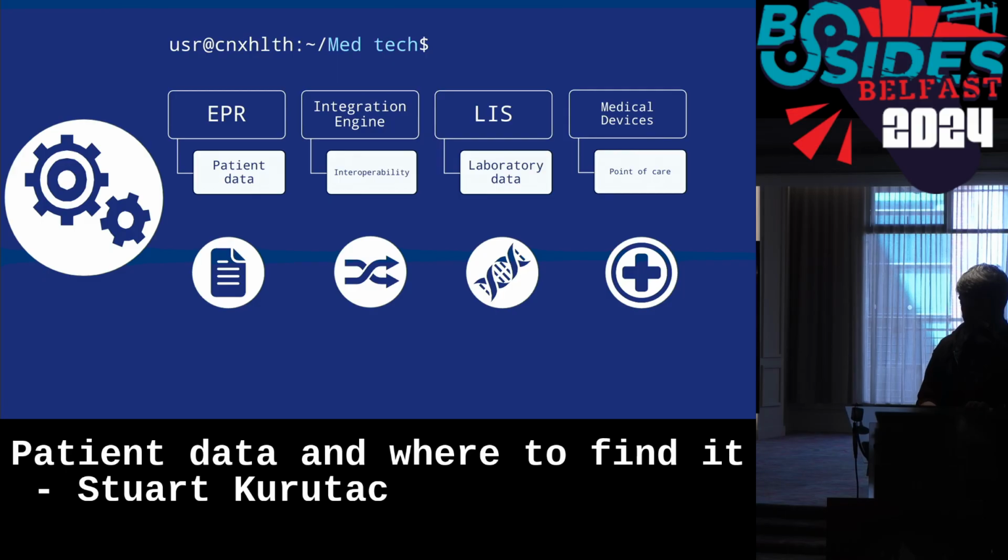My personal favorite is the integration or interface engine, which facilitates interoperability. There's a long-standing issue in healthcare organizations where there's loads and loads of devices, none of them want to talk to each other. So someone came up with one of these, which basically allows you to have a receiving interface. You can do some magic in between and it spits out a different message that's compatible with the receiving device.